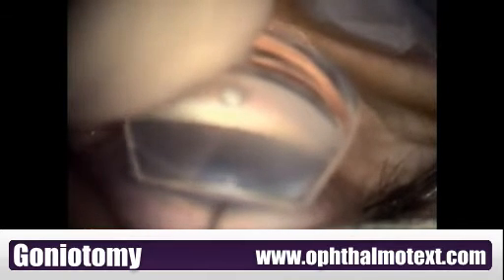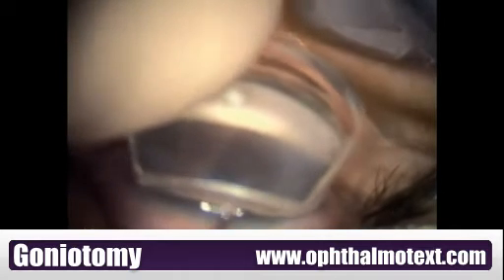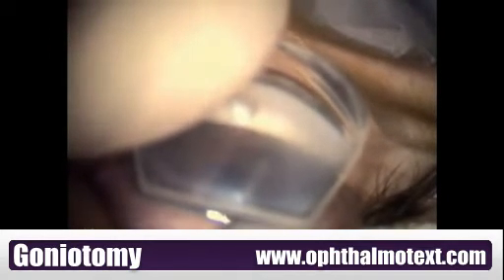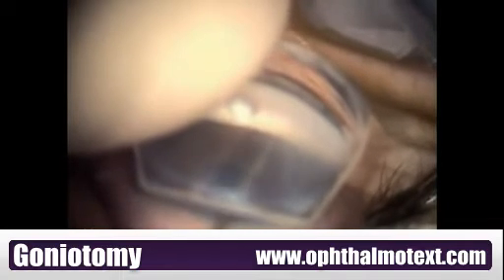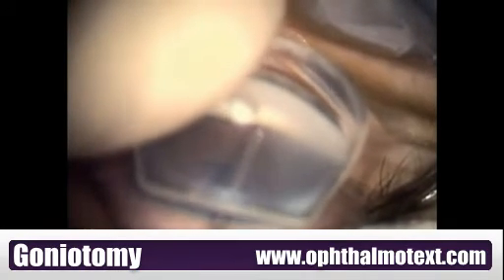surgeon. This is such that when the knife is entered into the anterior chamber and approaches the opposite angle, the hand actually straightens out so that it is in a more comfortable position during the actual goniotomy surgery. For a right-handed surgeon, I find it easier to do the surgery from right to left.